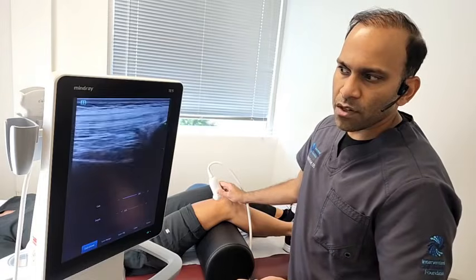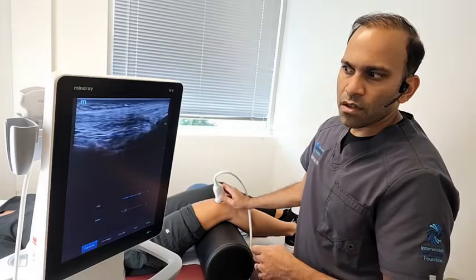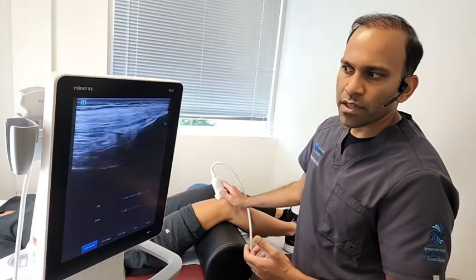But you can see in this situation that we don't have really a substantial amount of inflammation. You can argue that maybe there's a little bit over here, but ultimately everybody has a little bit of fluid inside their knee, so I'm not overly concerned by this.